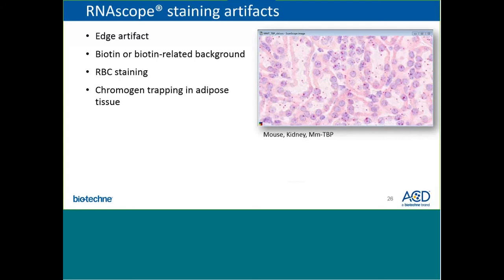An endogenous biotin background, most common in the kidney and liver, can also result in tissue with a pink haze almost reminiscent of eosin staining. This is distinct from the true signal of punctate dots seen in red. While there is not yet an official protocol to reduce this biotin background, which is quite common in kidney and liver, the ACD support group can certainly help with concerns or questions regarding this pink haze.